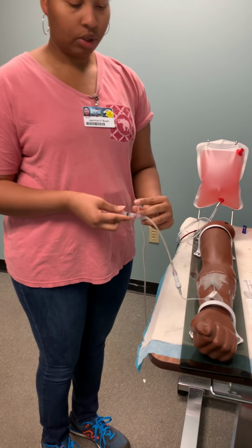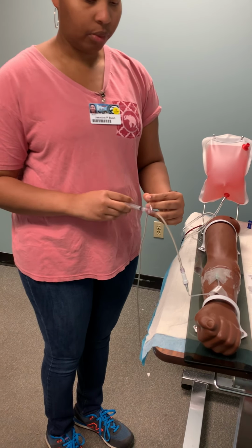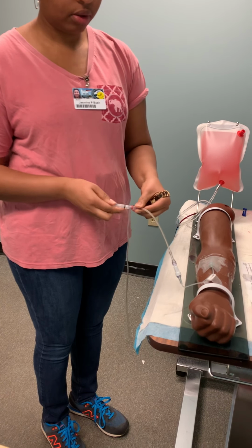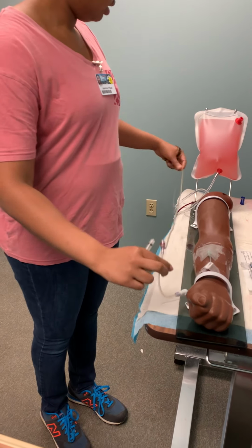Now clamp it one more time. I'll push the remaining. Let it run. All right.